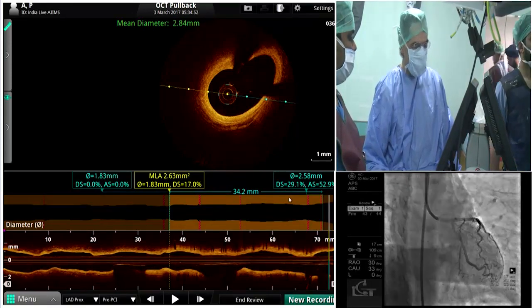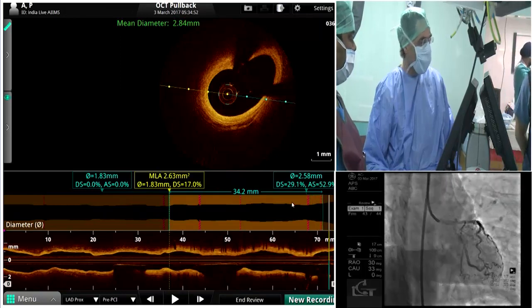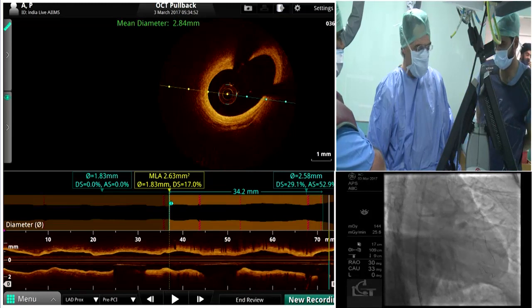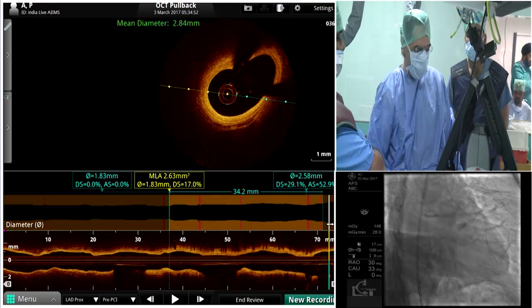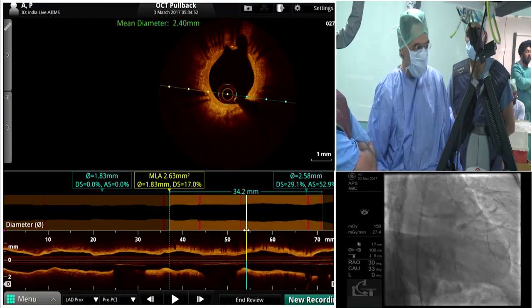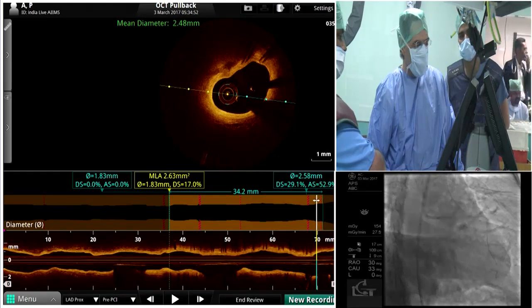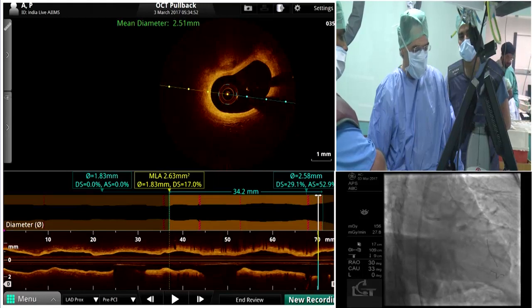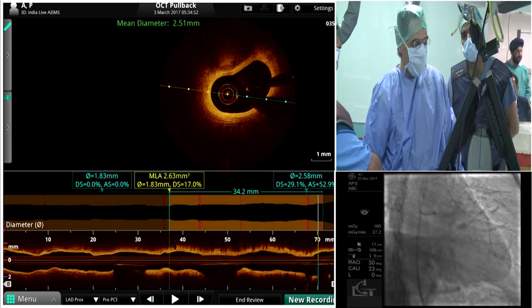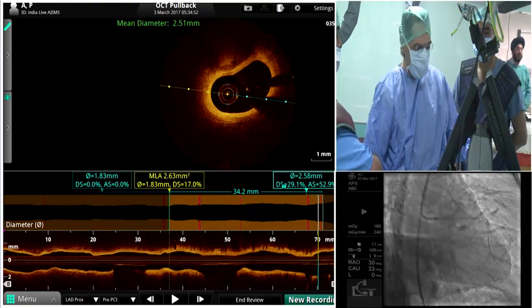So we acquired this OCT imaging, having a long pullback of 75 millimeters in 2 seconds. The target we have, and why we ran the OCT, is to try, number one, to see the expansion of the stent, and secondly, to check the bifurcation and to see which cells were crossed by the wire. In this case, you show this cartoon upward longitudinal view. That is the automatic lumen detection border. It's telling you about the measurements.